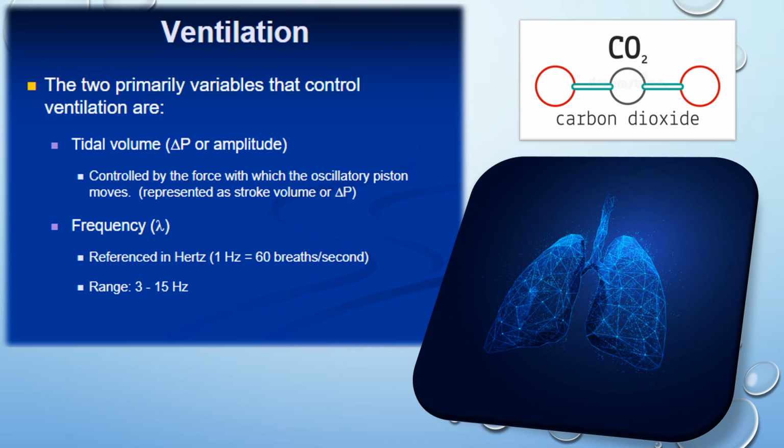To overcome the effects of the resonance frequency, clinicians can optimize ventilation by providing the correct frequency. Reducing the frequency causes greater volume displacement, resulting in a greater tidal volume and subsequent minute ventilation. In conventional mechanical ventilation, the respiratory rate is increased to blow off carbon dioxide, but HFOV operates in opposition to this. To decrease the carbon dioxide, the frequency should be decreased. If the patient is overventilated, the frequency should be increased.